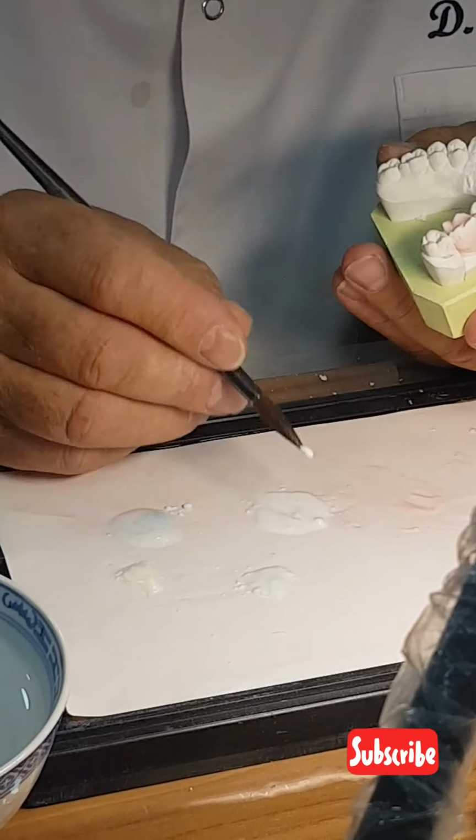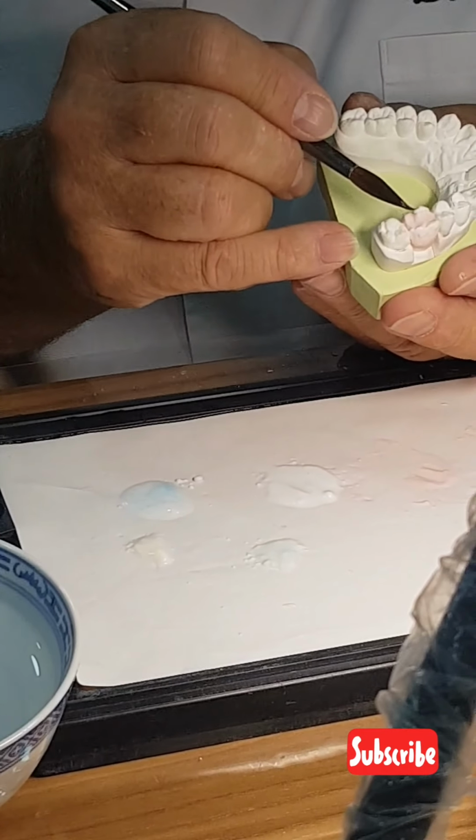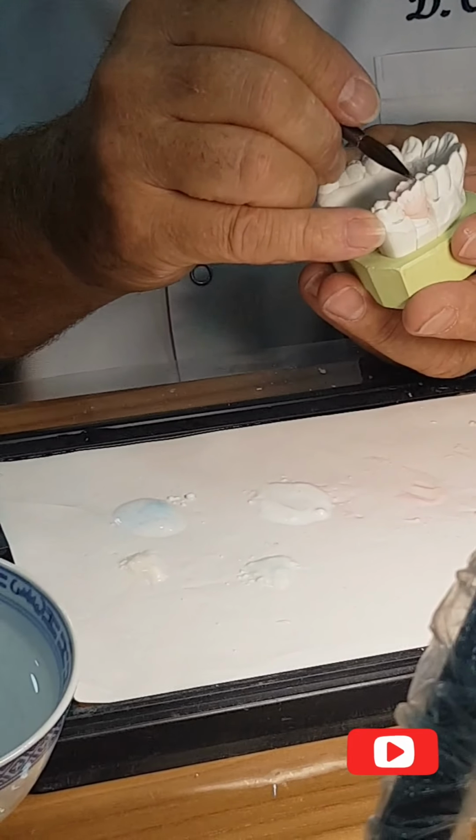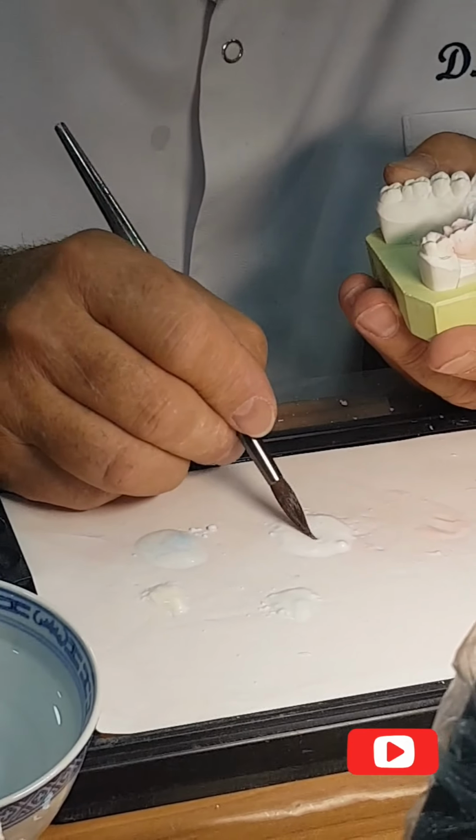And all around, like you know, Peter K. Thomas technique with the wax. Peter K. Thomas, PTK.